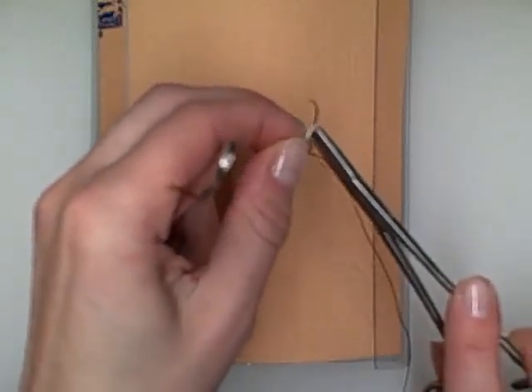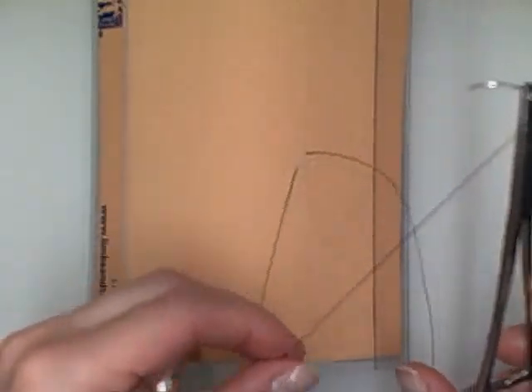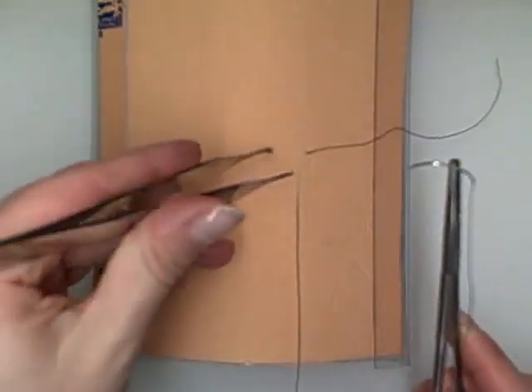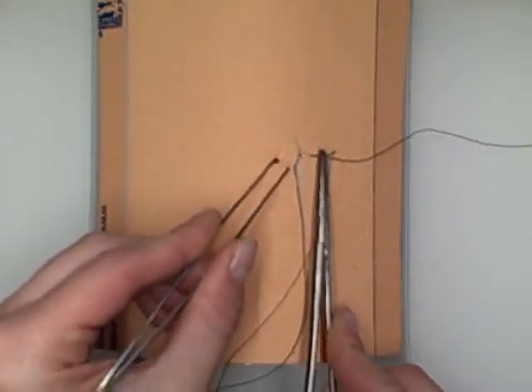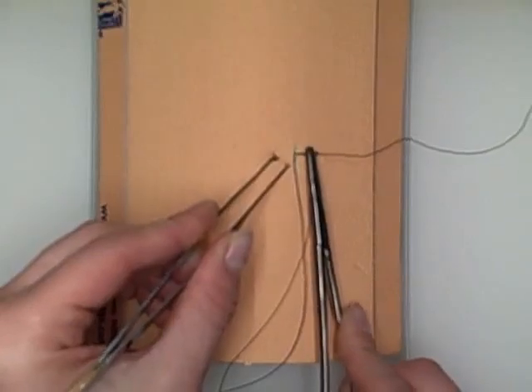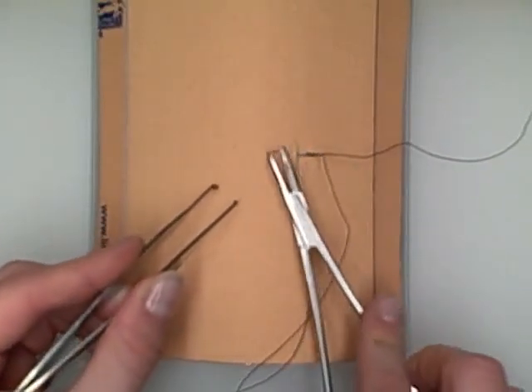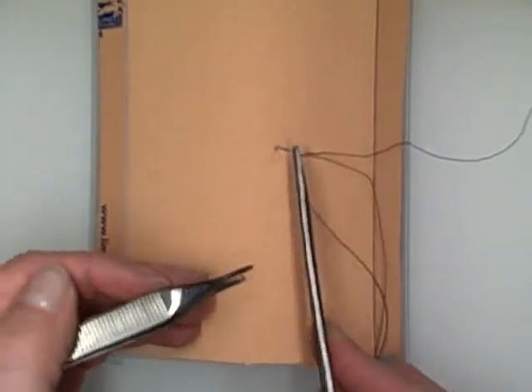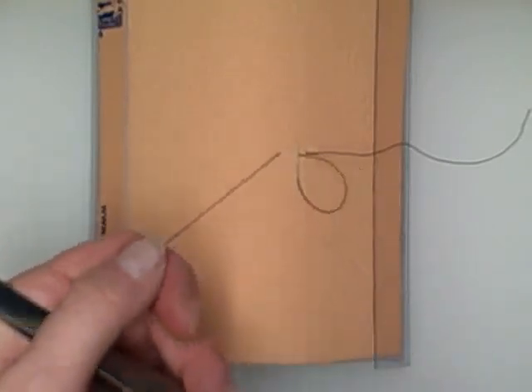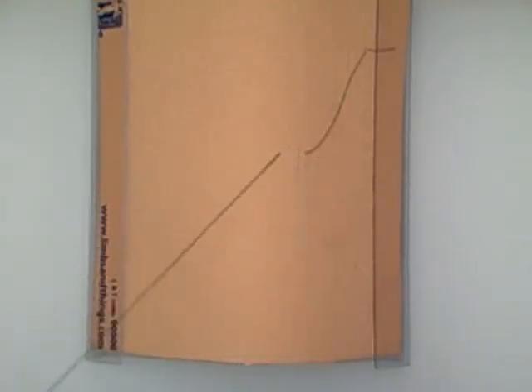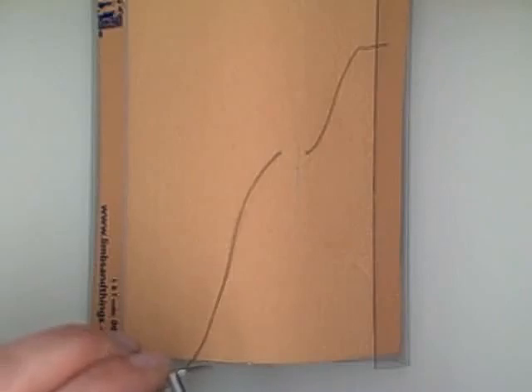The horizontal mattress suture is an everting suture technique. It spreads tension along a wound edge. This technique is commonly used for pulling wound edges together over a distance or as the initial suture to kind of anchor two different wound edges together.